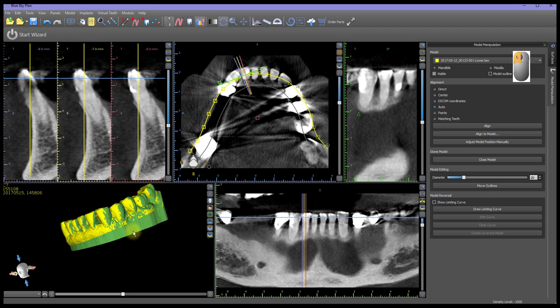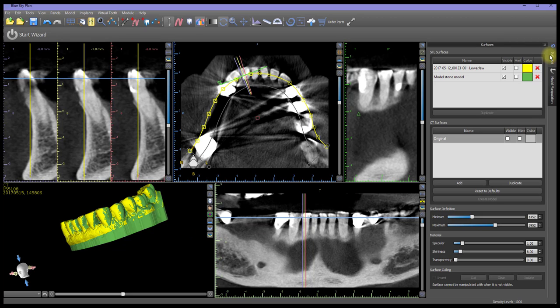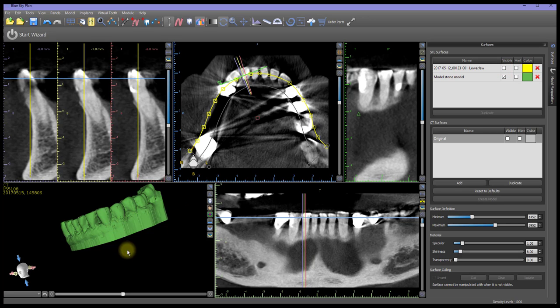Left-click on the Surfaces tab to open the Surfaces panel. Left-click on the Visibility checkbox of the original open model in order to hide it. The closed model, named Model Stone Model by the program, now appears as the only surface in the 3D view.